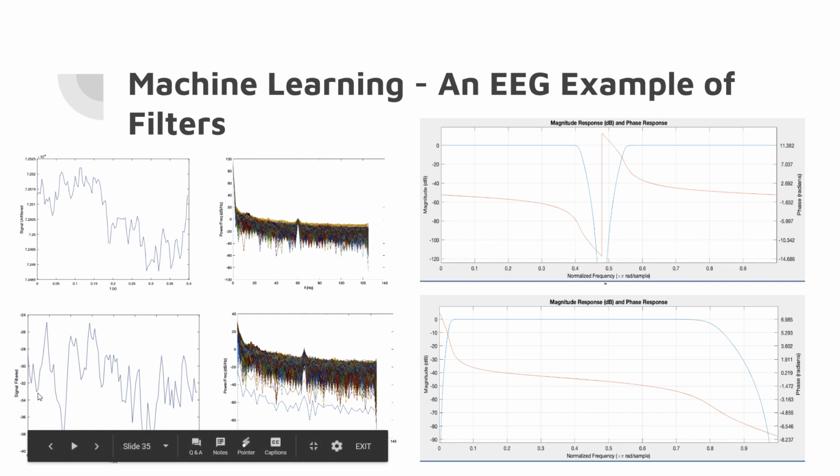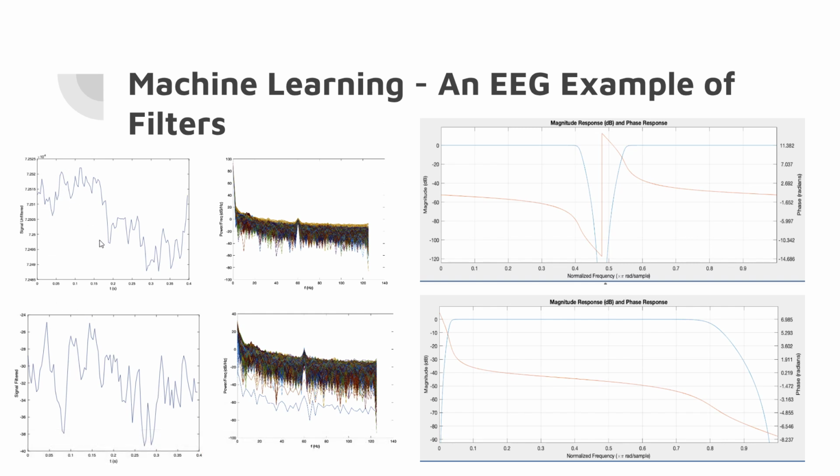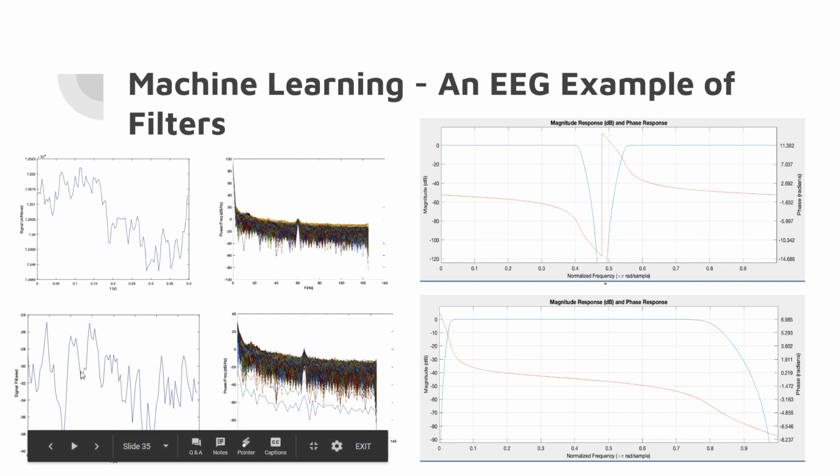So this signal is much smaller, and not only that, but you can kind of recognize some of the local features still in this signal, but this big wave you see, this lower frequency, is gone for the most part. Like, you can kind of see it a little bit, but for the most part it's been removed.